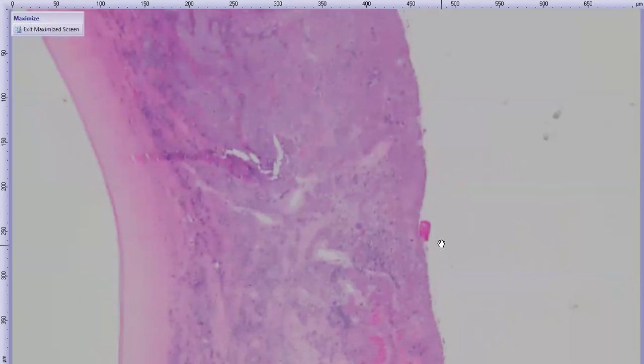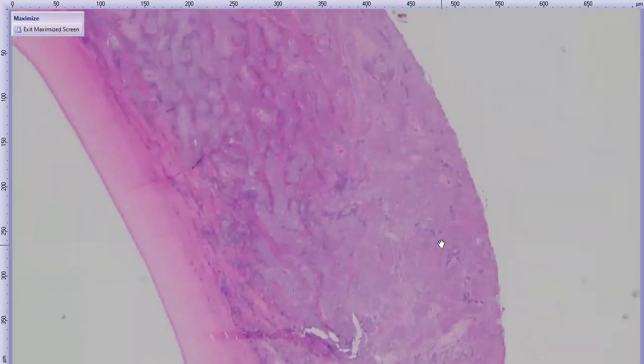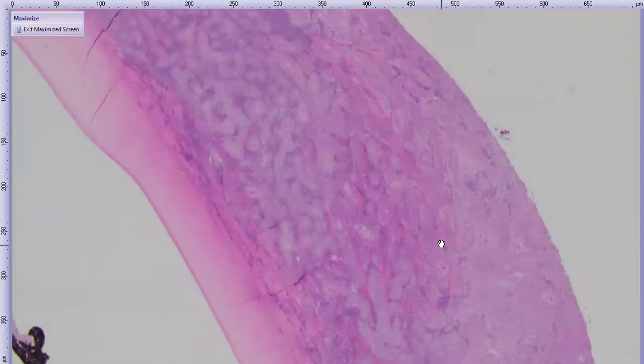Or immune-mediated keratitis. That's a good point. Or immune-mediated keratitis, confusingly abbreviated as IMMK. I guess we include the M from the immune. But eosinophilic keratitis is a different one too. Eosinophilic keratitis, that's a good one too. Actually, eosinophilic keratitis was a differential for that cat we just looked at too.